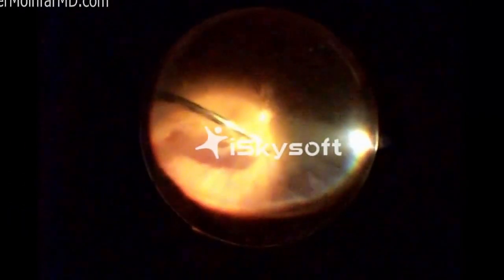Now this video has not been edited so that you have an appreciation of the true time frame and steps involved. So the procedure in this video takes about 30 minutes, and that's about typical for vitrectomies. This patient also happens to have a traction retinal detachment, which adds about an extra 10 minutes to the surgery. Most of these cases take about 30 minutes, and again this has been unedited, so sometimes there are pauses as we adjust our microscope, adjust our lens, and sometimes just pause to recheck the configuration of our instruments and the parameters on our vitrectomy machine.